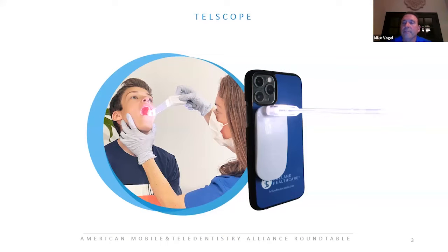TelScope actually takes your smart device, whether it be an iPhone or Android, and turns it into an intraoral camera. So it's a very simple system. It has a handle with a USB charge, 2.5 hours on a charge. It is antimicrobial. And then you have these little single-use blades, and it illuminates when you connect. So it's very simple. And then I'm going to go ahead and share my screen.